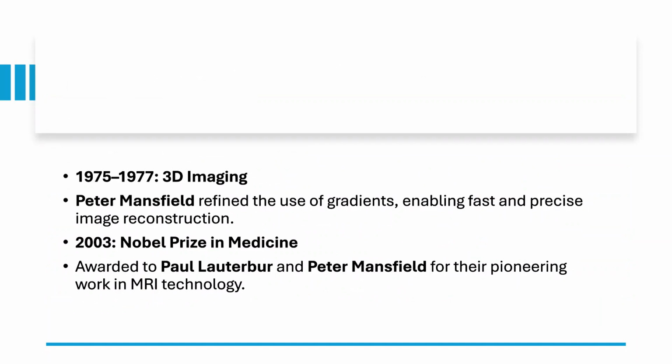Further, in 1975, Peter Mansfield refined the use of gradients, enabling fast and precise image reconstruction. In the year 2003, Paul Lauterbur and Peter Mansfield, both of them received Nobel Prize in Medicine for their pioneering work in the MRI technology.